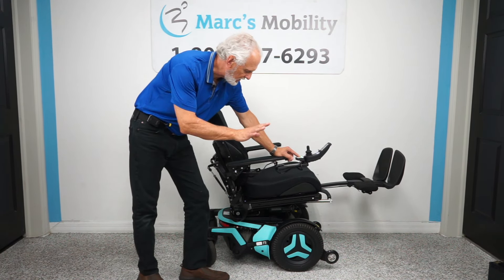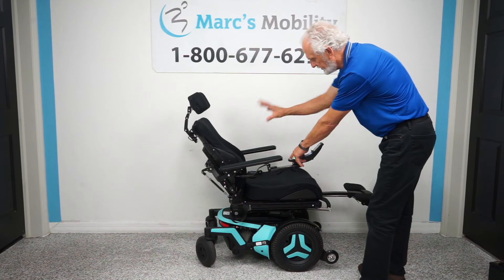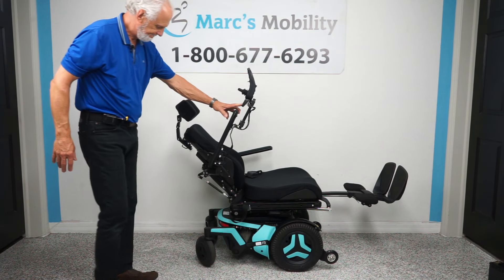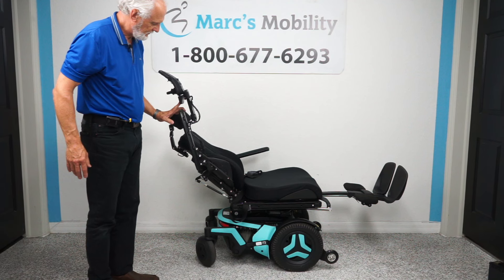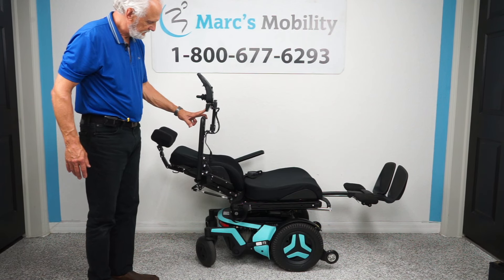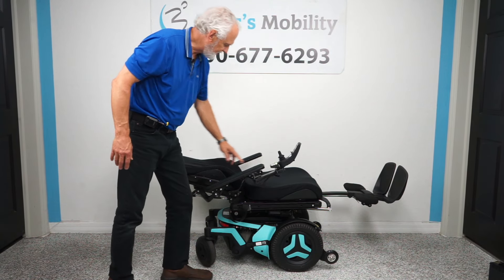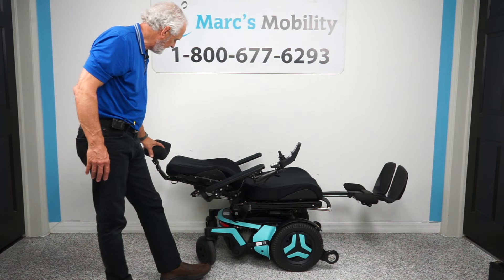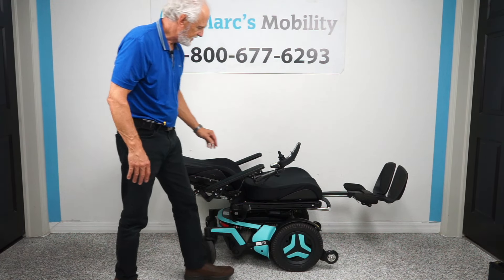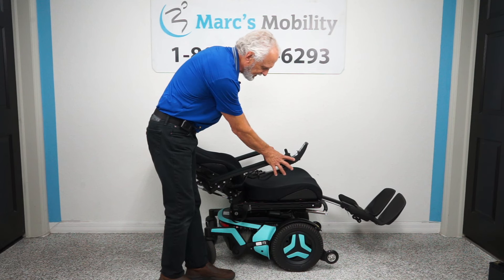We've done four electrical functions so far. The last one is called the electric recline — this is the back going back by itself, nothing else moving. I'm almost all the way back — it's not completely flat but nearly. This would be the laying position. I'm going to bring the back up and the legs back down at the same time — you can do two buttons at once here, or do it through the joystick.